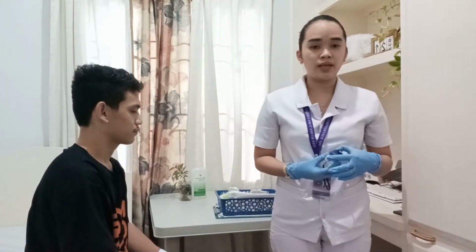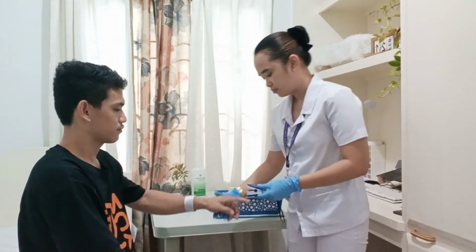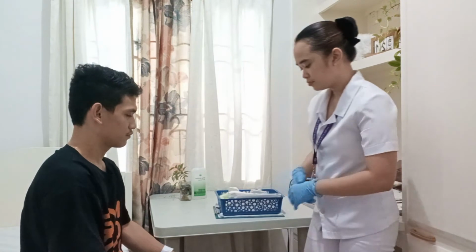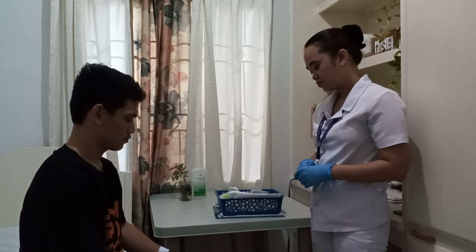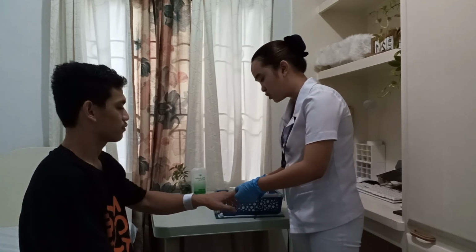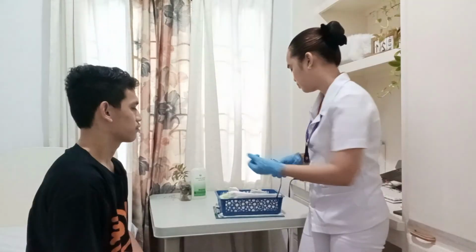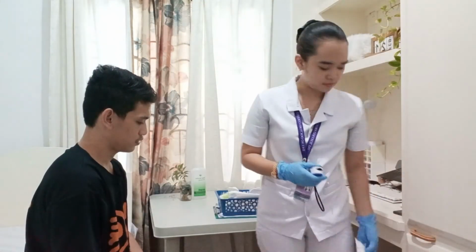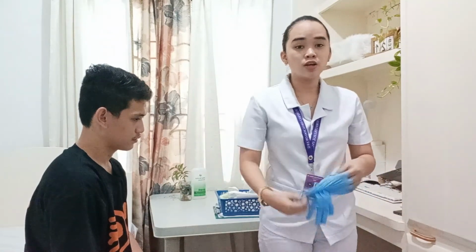Okay, now I'm going to place the pulse oximeter on the index finger of my patient. Now we'll wait for the result. Okay, Mr. Patrick, your oxygen saturation is 98, which is a normal range. Now I'm going to disinfect the pulse oximeter. Also, I will remove my gloves and perform hand hygiene to avoid cross-contamination.